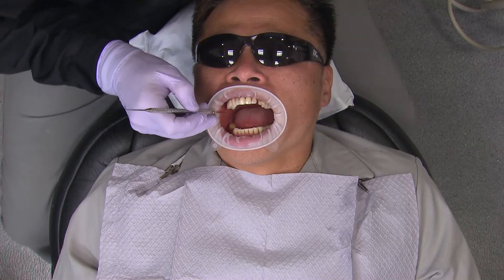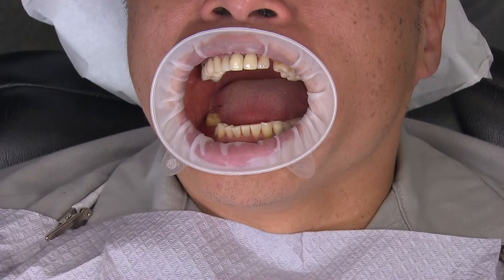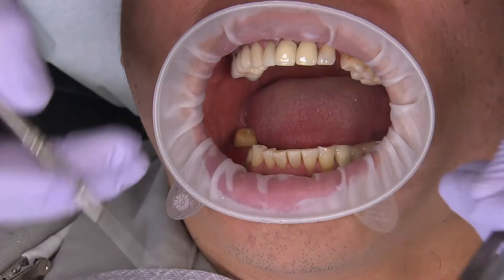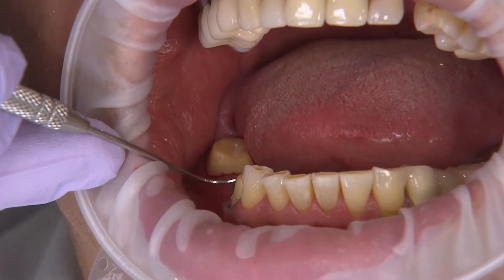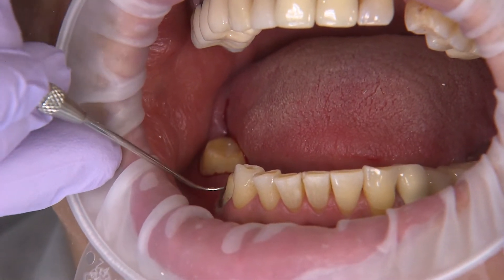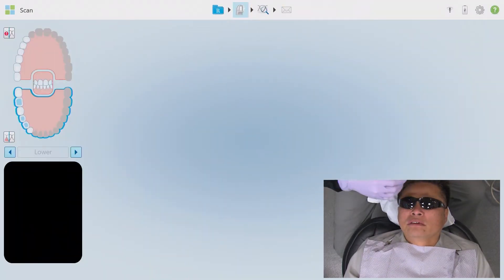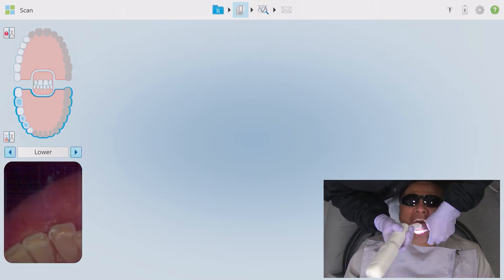At this point, I'll go ahead and remove the remaining retraction cords. I do want to mention that the removal of only the top cord during the scan process is just a guideline. If sulcular bleeding is negligible or you are able to acquire a better scan with no cords left in place, then definitely take both out. I do however want to stress that it is important to perform cord removal on a tooth by tooth basis. Well, I've taken the lip retractor out of the mouth at this point. I mentioned in a past tutorial that I prefer to perform the full arch scan portion with no distractions such as retractors or mouth mirrors if I can help it, and this situation isn't any different.